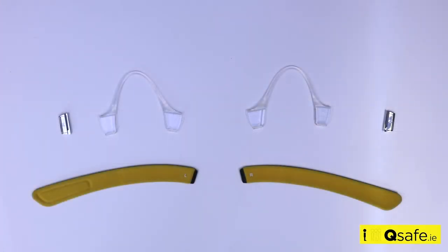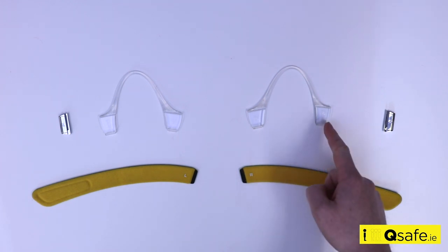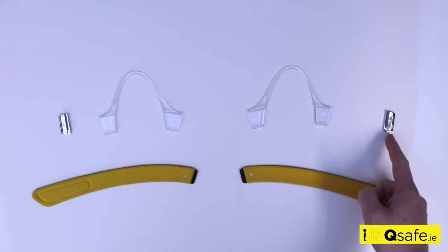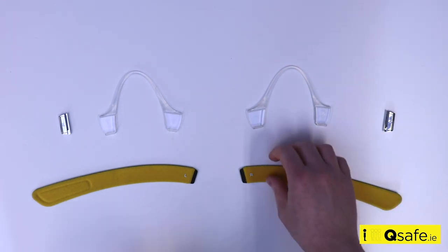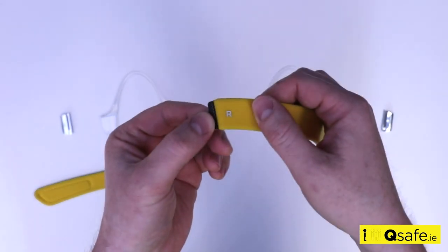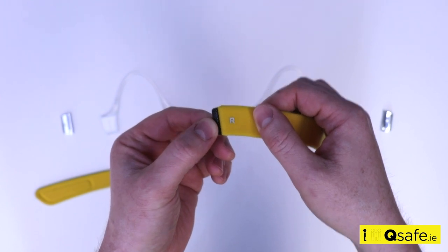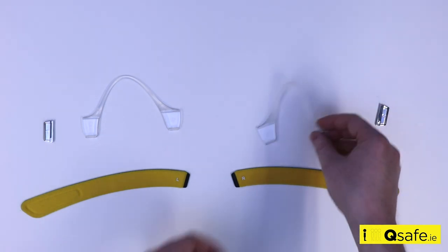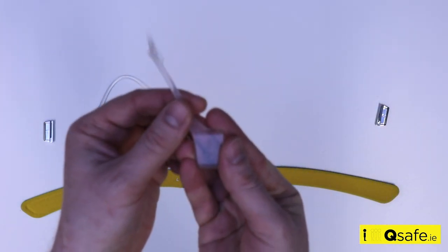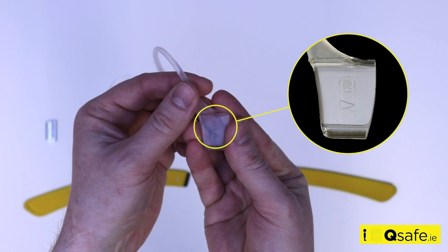When reassembling the headbands, make sure to assemble the right side headband strap, the matching silicone ear hook and the matching clasp together. All the components are labelled R for the right side and L for the left side. When sliding the ear hooks on, attach the clear plastic hook with the arrow first.